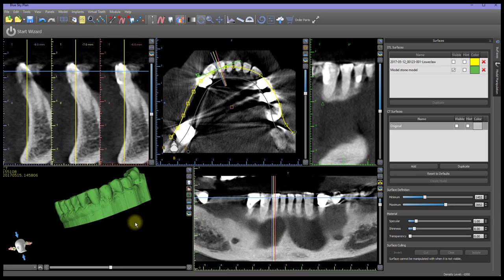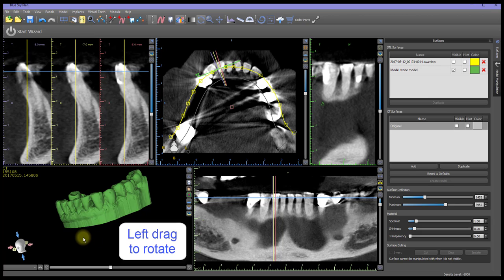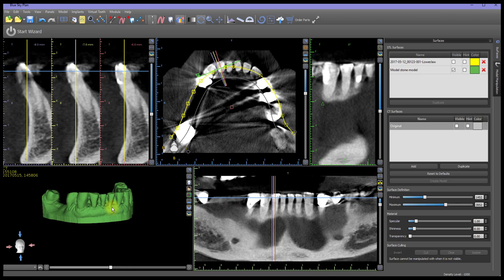Teeth can now be extracted from this model. In the 3D view, left-drag the mouse to rotate the model so there is a clear, unobstructed view of the tooth to be removed.